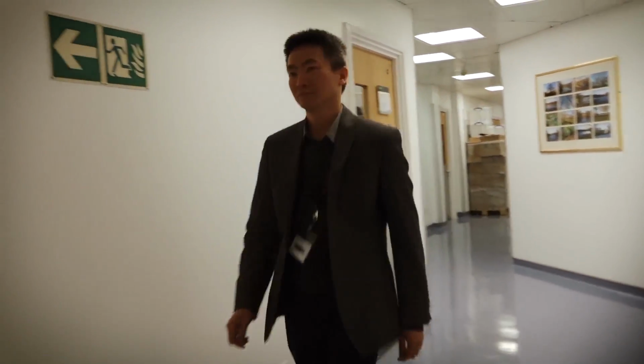I am a senior lecturer in the Department of Medical Physics and Biomedical Engineering. So as Raj just described the problem to us, we want to create a home monitoring system based on low-cost digital cameras and processing units in order to capture two features from the liver patients. The first one is jaundice.